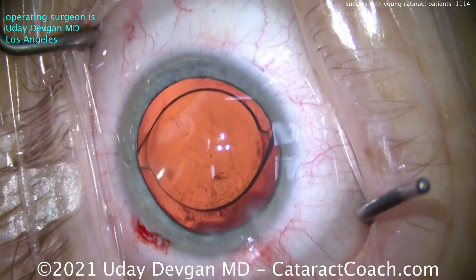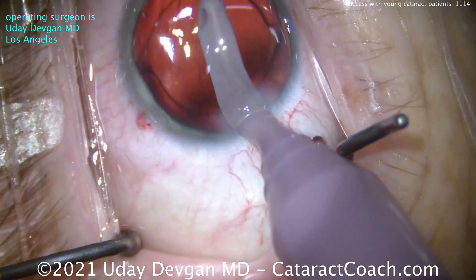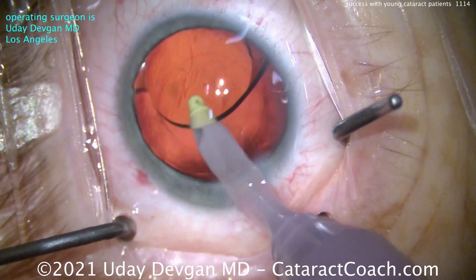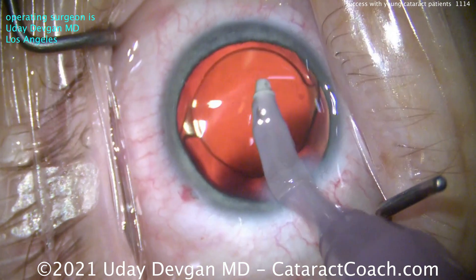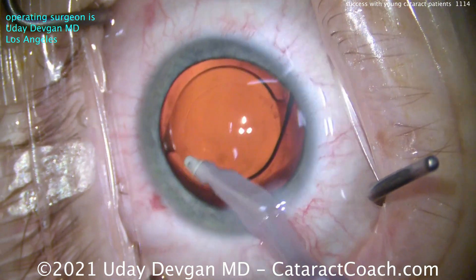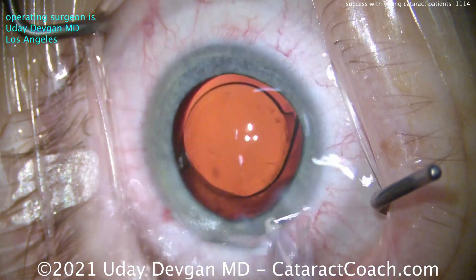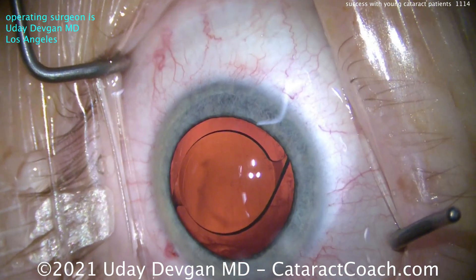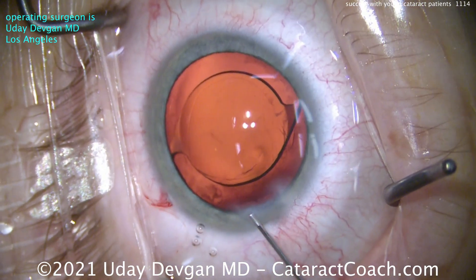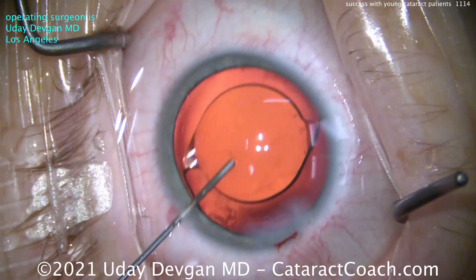In the patient's other eye, the cataract is not as significant and the patient won't need surgery in that eye right now. We're leaving some significant anisometropia between the two eyes, but the patient can wear a contact lens in the other eye. Now the other eye doesn't have zero cataract, and at some point in the future that other eye will need surgery as well. If you talk to a lot of ophthalmologists — myself included — and ask what they'd want for their own eye surgery, I'd also choose a monofocal lens with the best visual quality, and I'd also choose to retain a mild degree of post-op myopia, because my world is up close. I don't mind wearing glasses to drive a car, watch TV, or play sports, but I want to see up close, do computer work, read, and use my cell phone without glasses.